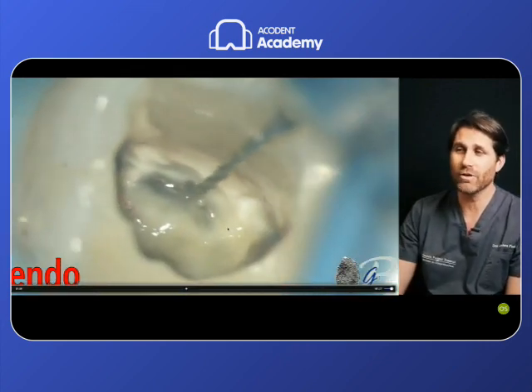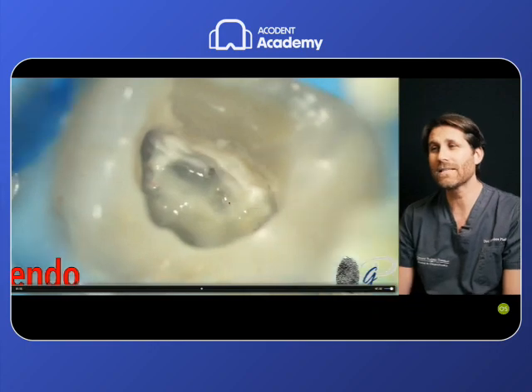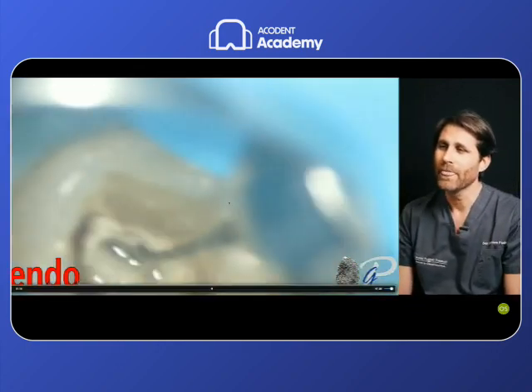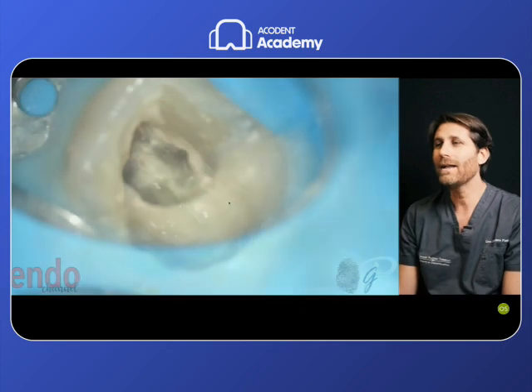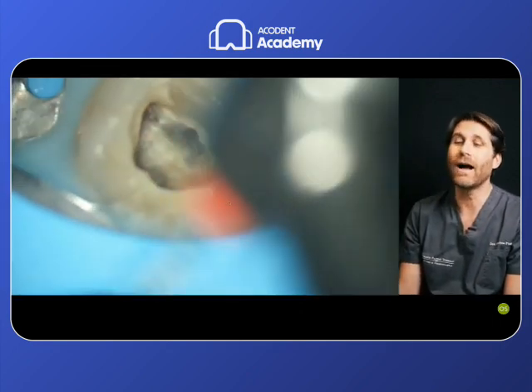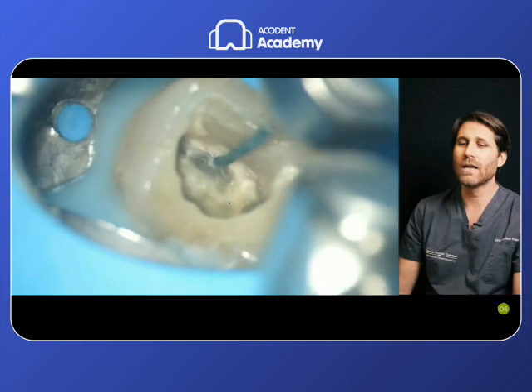fracture resistance or deformation resistance, but it's also effective in cutting dentin even if it's small and flexible enough to follow any curvature possible in this case. So this is the technique for how to scout these very difficult, seemingly impossible root canals. And then after opening this orifice and this root canal up to the apical third, we can proceed with our standard procedures, with our standard file for the root canal preparation.